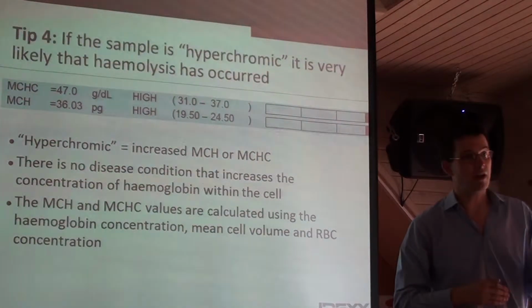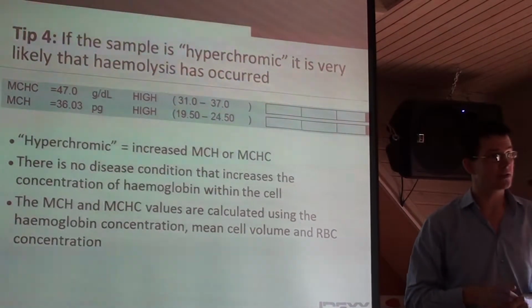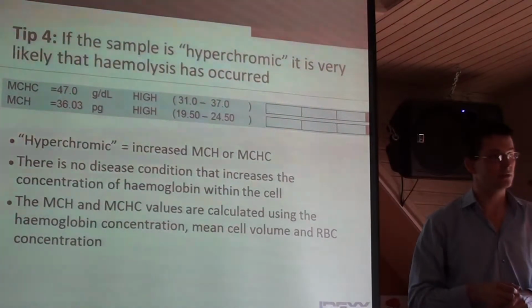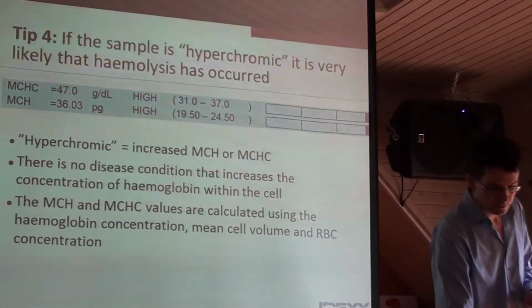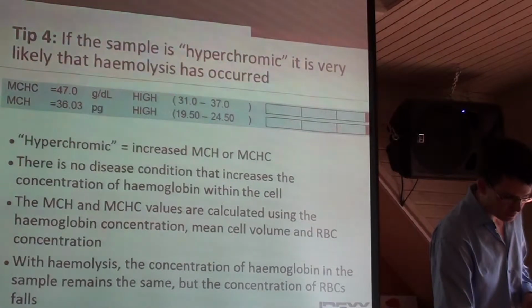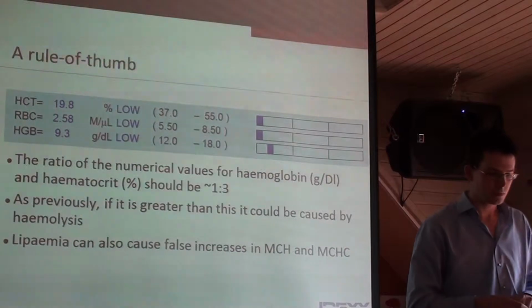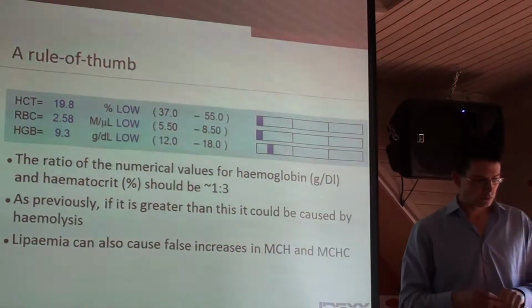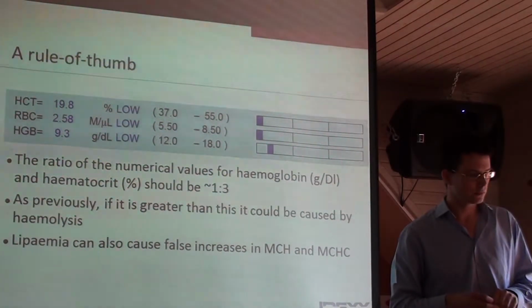But just because you have numbers doesn't mean they're necessarily the right numbers. And frequently, with bad sample quality, we are forced to do a manual differential, which is inherently imprecise.